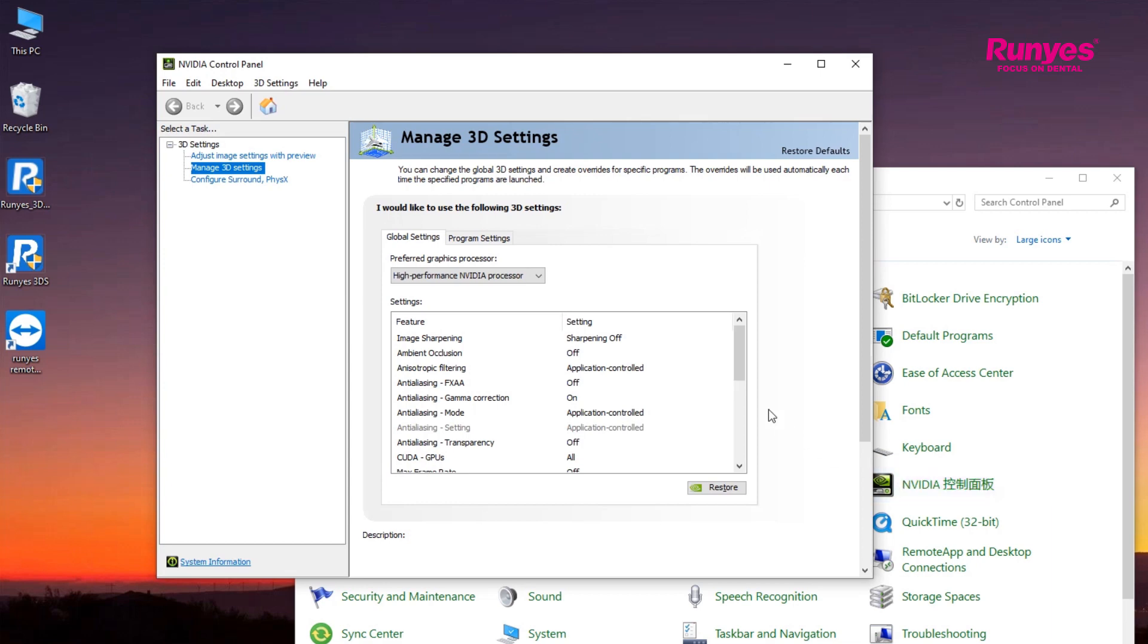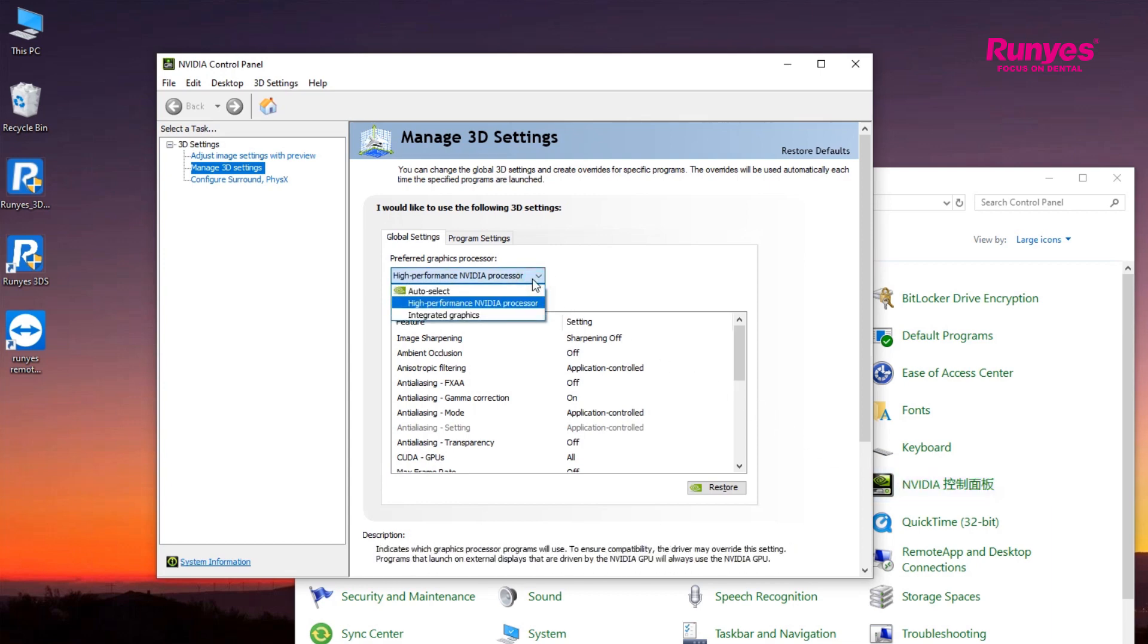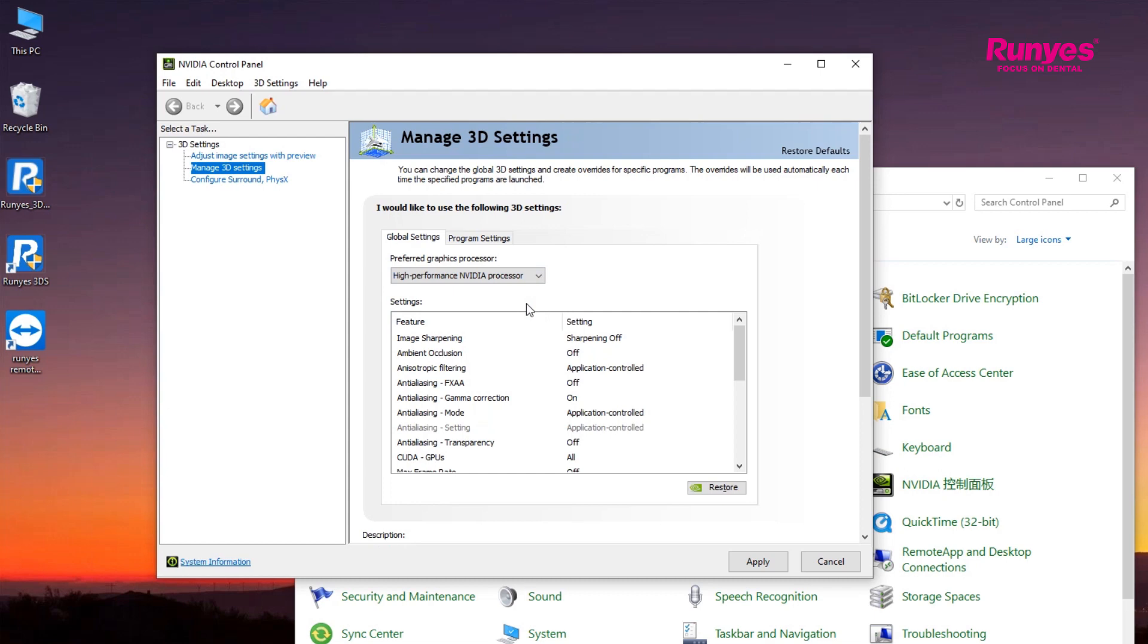Enter the 3D management settings and select High Performance NVIDIA processor in Preferred Graphic Processor in Global Settings.